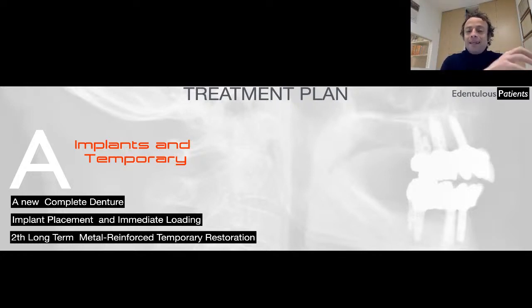It is exactly like the final restorations that many doctors in many clinics all around the world prepare for their patients. But I don't like to call it final. I like to consider it always a long-term metal reinforced temporary restoration. And in this lecture, I want to be really clear with you about everything.